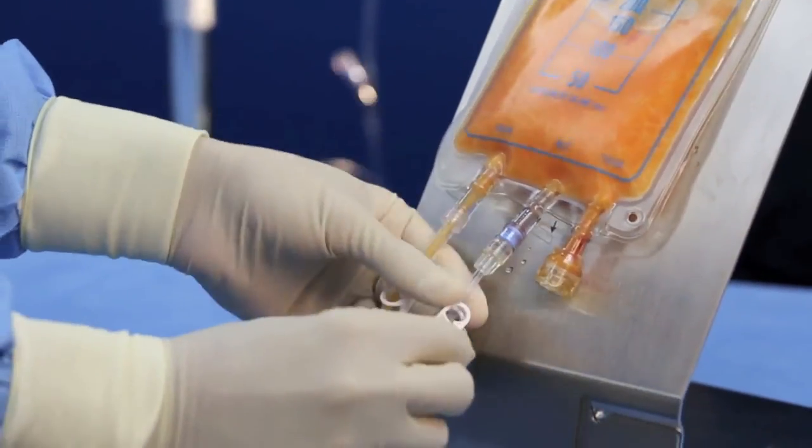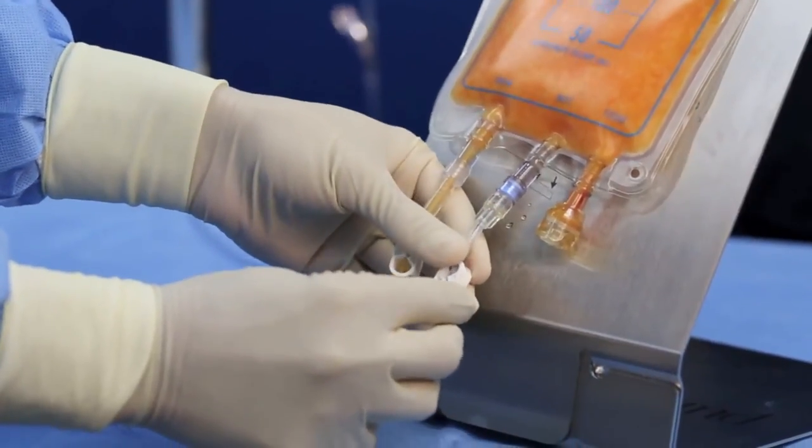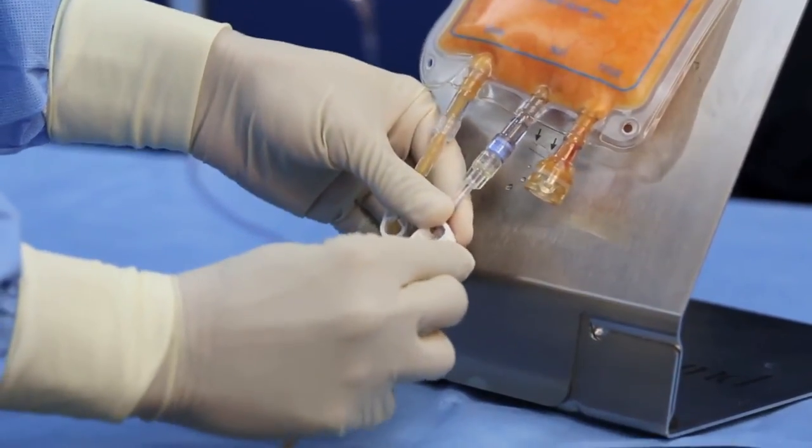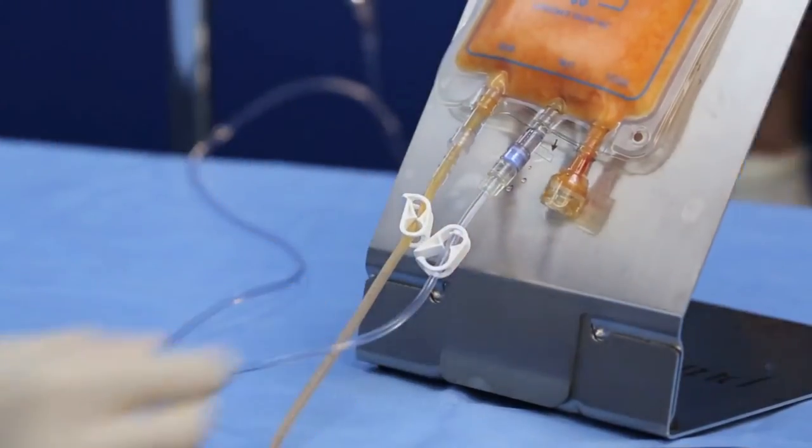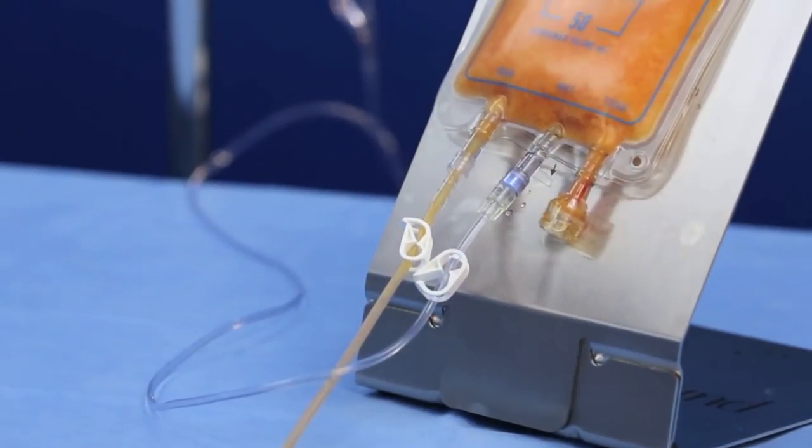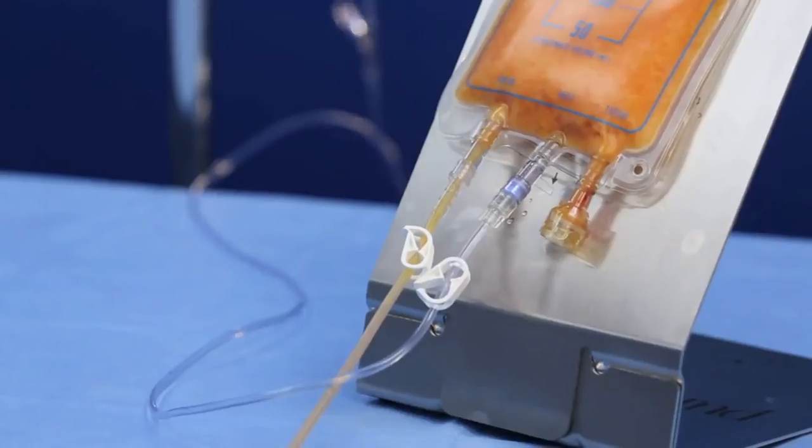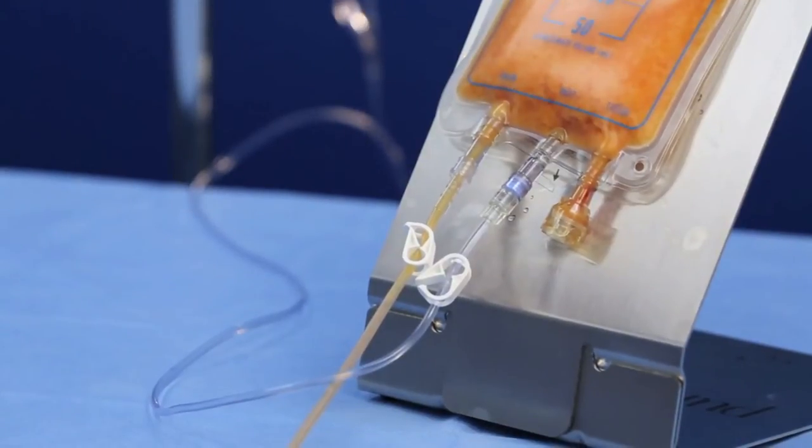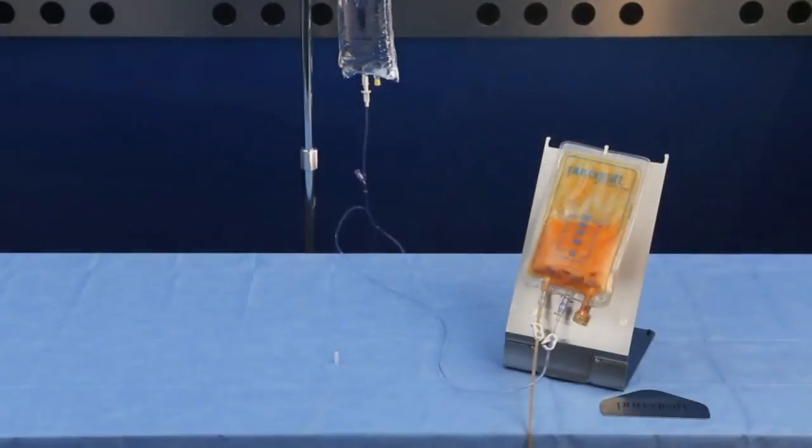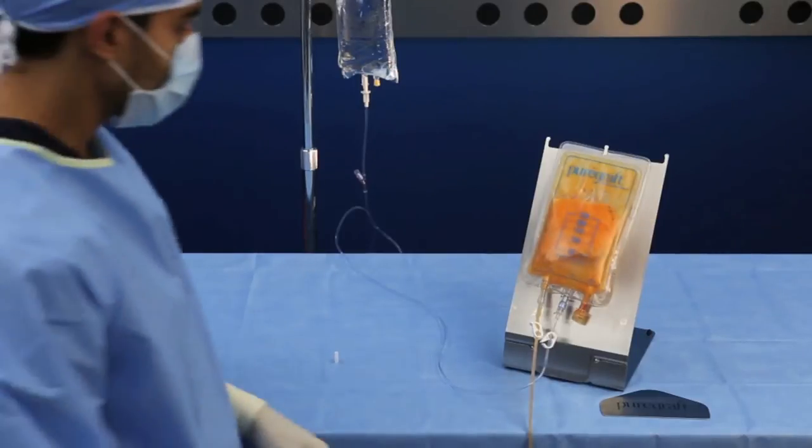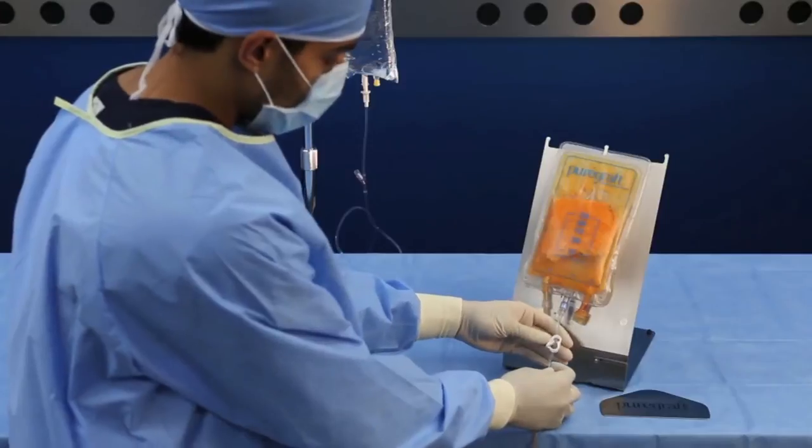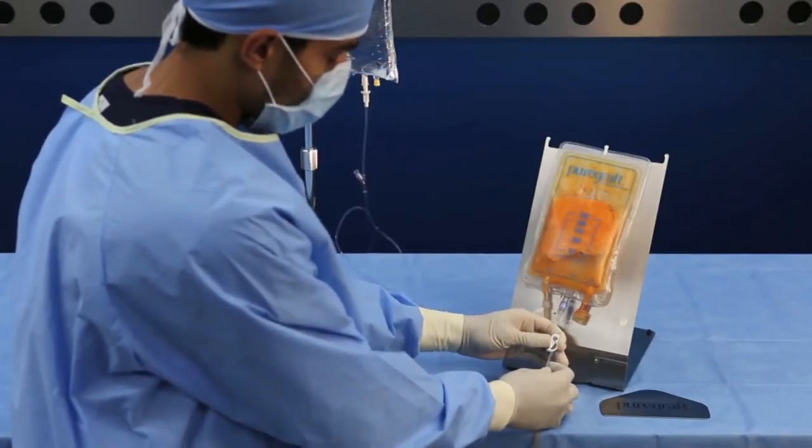Once both sides of the inlet tubing set are attached, open the clamp to add the desired amount of lactated Ringer's solution. Close the clamp and disconnect the inlet tubing set.